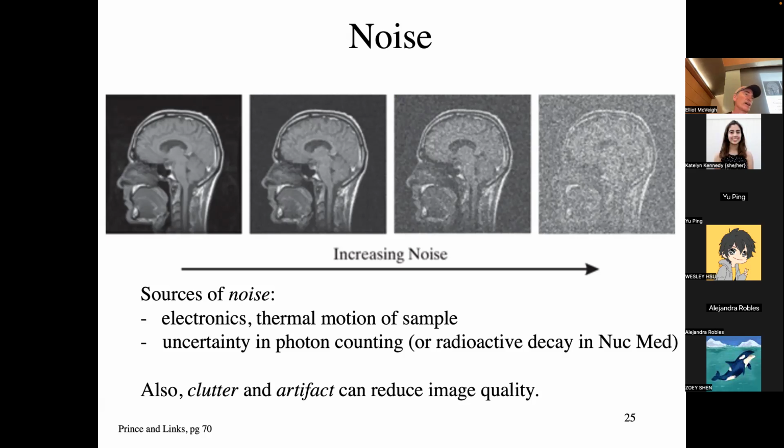In MR, artifacts come in all sorts, shapes and sizes. You can get a flipped mirror image of the whole field of view just superimposed on your picture. You can get repeated structures in the phase encoding direction. If they're moving, for example, if there's some kind of a vessel in the field, it can show up a bunch of times, right, at different offsets. And my theory, or my creed by which I live, is that one person's artifact is another person's technique.